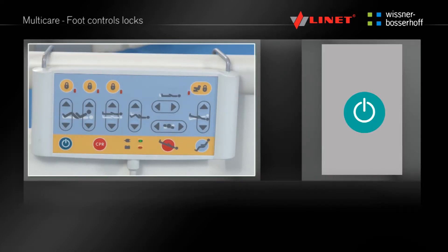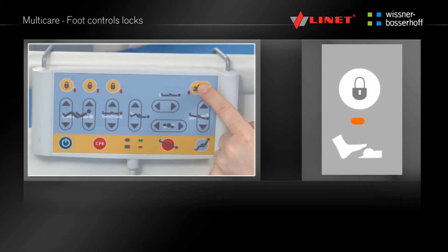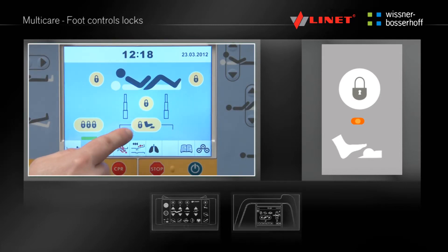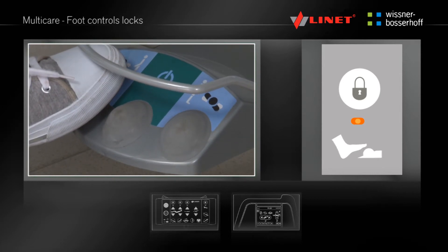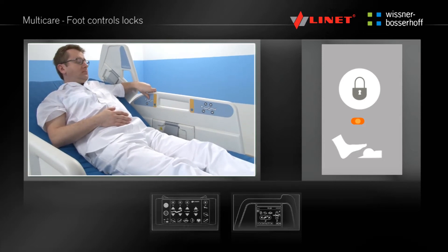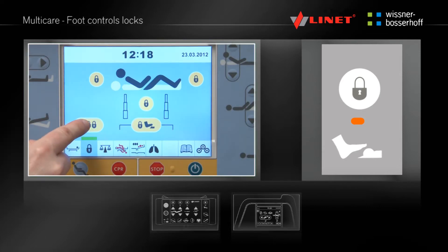Activate the function by pressing the Go button. The foot controls can be locked by pressing the Lock button on the Supervisor panel showing a symbol of the foot controls, or in the Lock menu on the multiboard. After pressing, the foot controls will be disabled. Locked foot controls are indicated by a yellow indicator light near the locking button on the Supervisor panel. The other control elements remain fully functional. To unlock the foot controls press the Lock button. The foot controls are activated when the yellow indicator light is off.